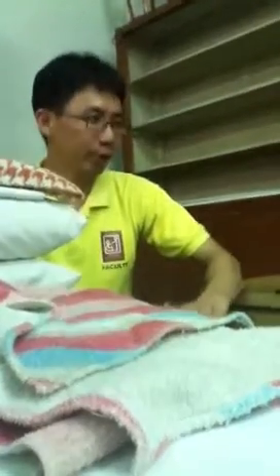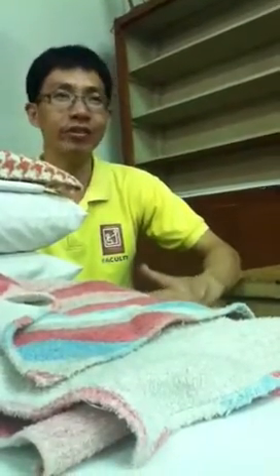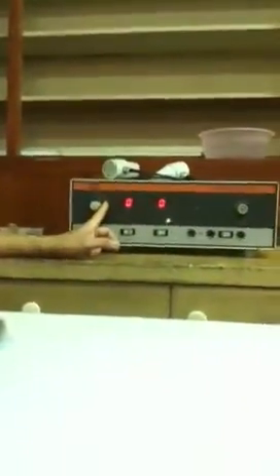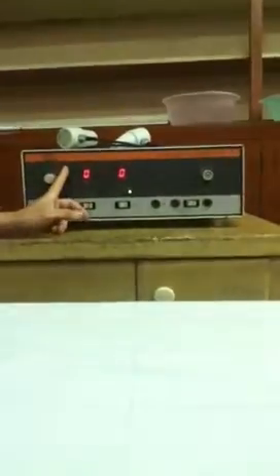Pulse. In the pulse type, it doesn't always deliver ultrasonic energy, so there's less thermal effect. You have 3 types of pulse ultrasound here. This is the ratio: 0.5 is to 9.5, 1 is to 9, then 2 is to 8.